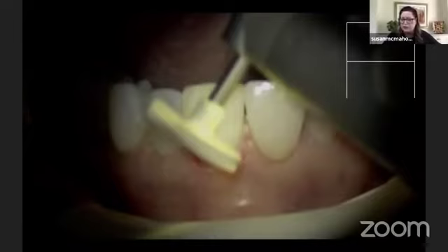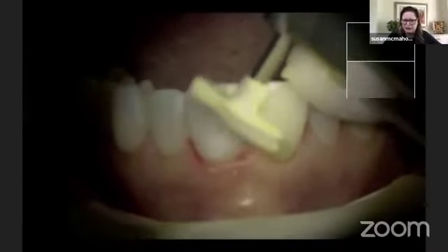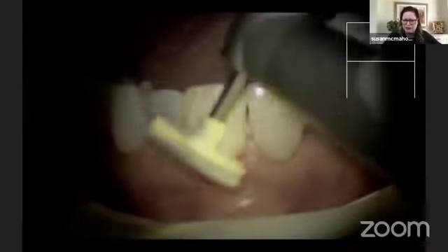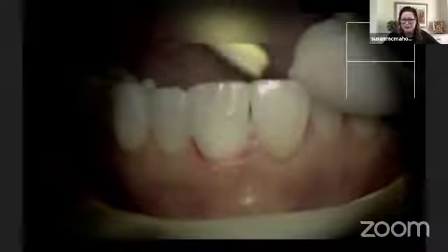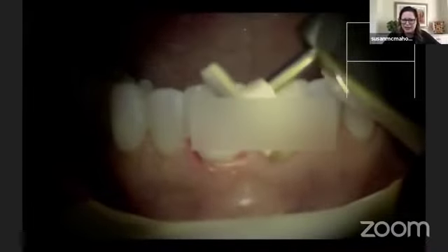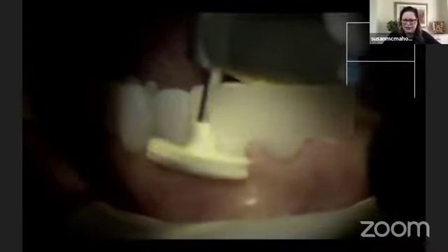Switch it out. This is the white, the fine polisher. Same situation, and you can use this as much as you want to get it as shiny as you want. You can really see the shine starting to come through there. Sorry for my focus, but you see the striations happening there too. We're getting that same thing that she has on her other tooth, and I'm going to polish this as much as I want and blend it in.